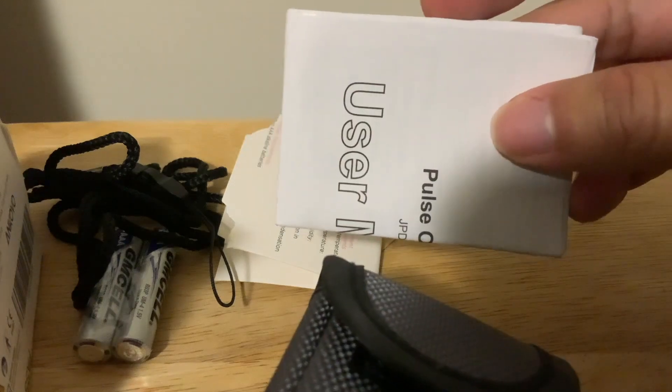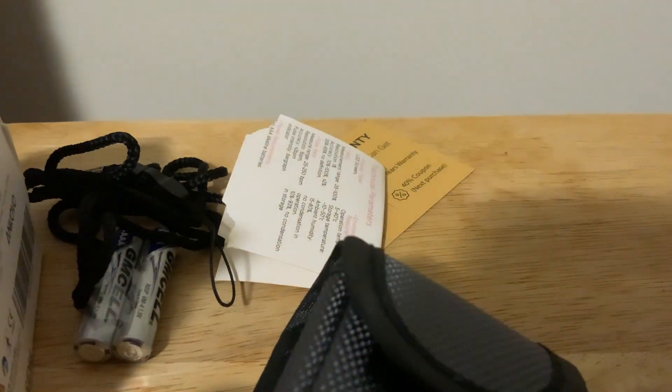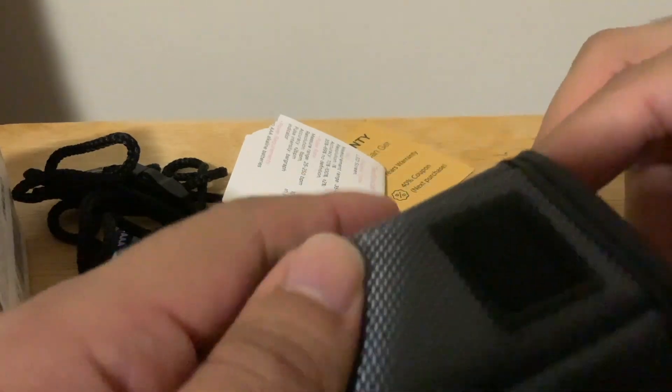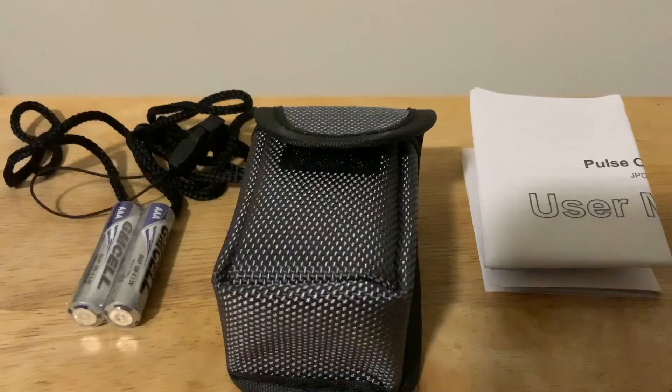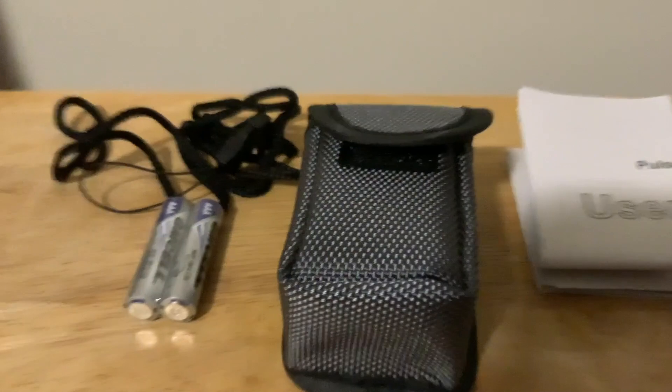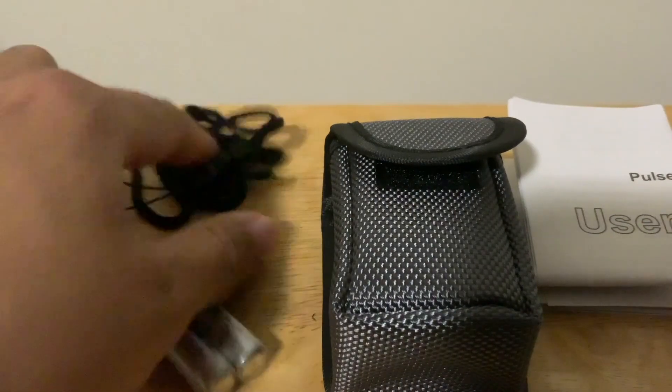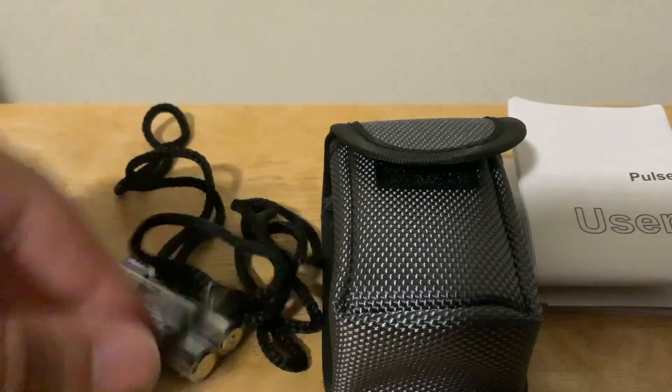User manual. You can see it comes with a battery, the case, a structure manual, and a little loop thing to hold onto it and grab it.